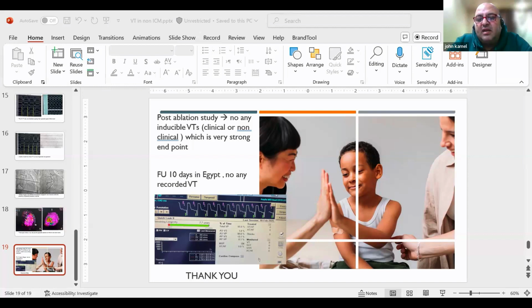So I'm sure there is nothing away from these two scars. The unipolar endocardial map would give me some information, but in such a case I know there is an epicardial substrate. We started endocardial, yes, definitely.